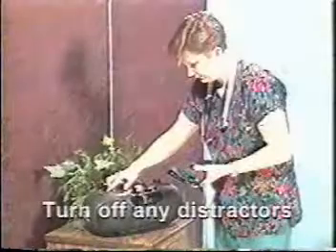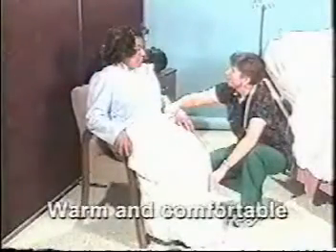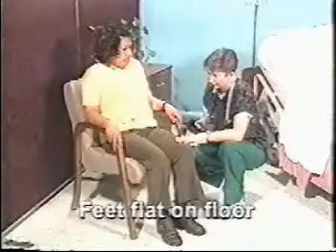Be sure to turn off any radio, television, or other source of distraction when taking blood pressure so that you can hear very clearly the blood pressure reading. The patient should be warm and comfortably lying or seated in a chair. Refrain from taking a blood pressure for 30 minutes after the patient has had a cigarette or other tobacco product. If the individual is seated in the chair, their legs should be flat on the floor and not crossed. If they are in bed, their legs should be straight and not crossed.